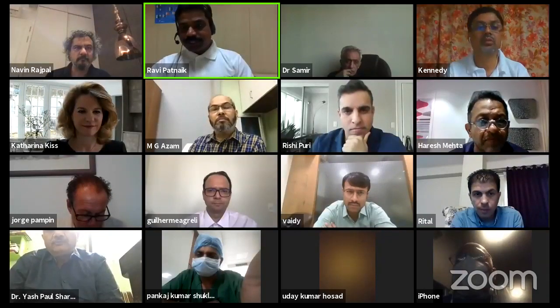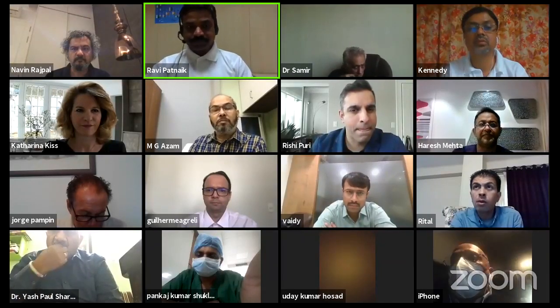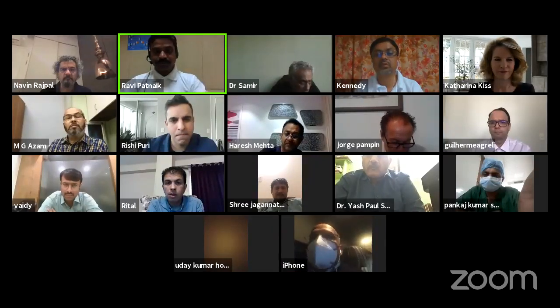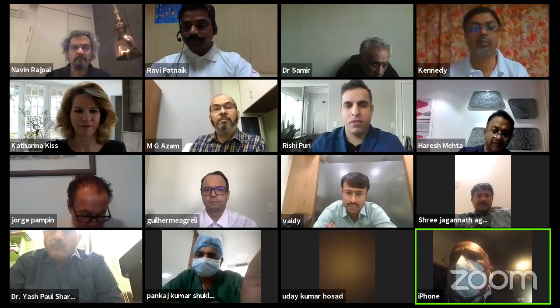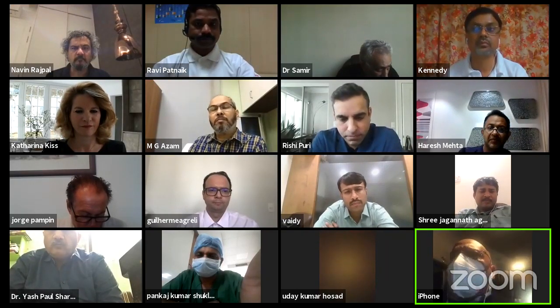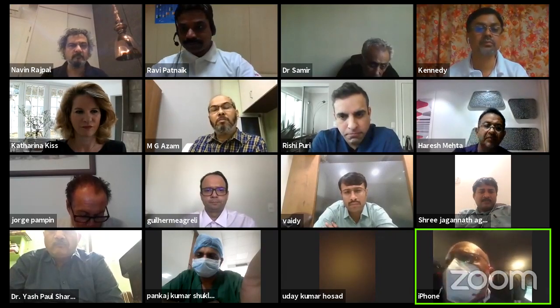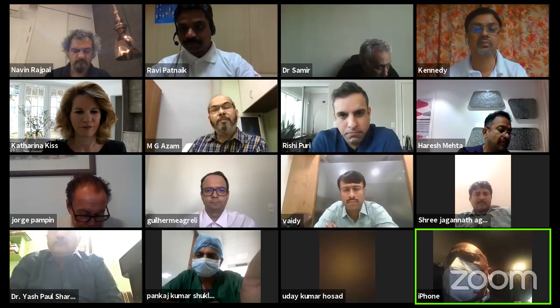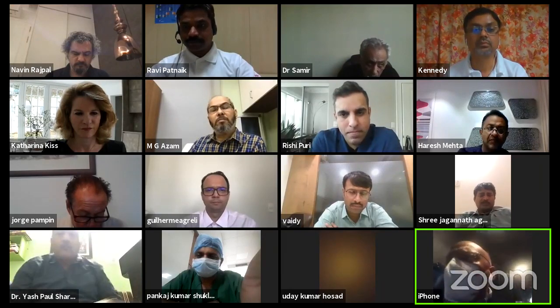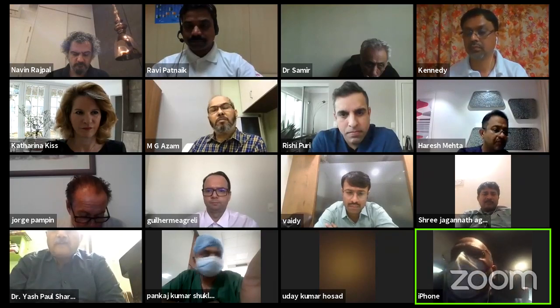Sir, there is a question on the chat. What happens to the risk of AF? Any other question from anybody? So as far as the AF is concerned, AF is an independent phenomenon, and these patients already have dilated RAs. So we typically don't have to worry about the atrial fibrillation. It's inevitable, I must say. Almost 70% of these patients who have been done or who are in studies already have AF, and some of them may develop it in due course of time. And since anticoagulation is being given already, it really doesn't matter.